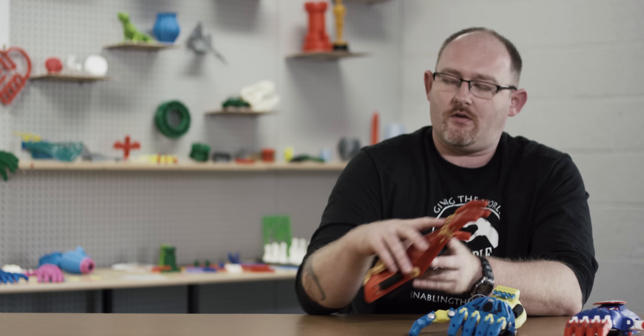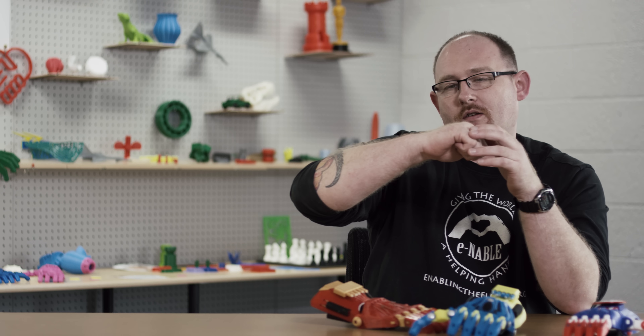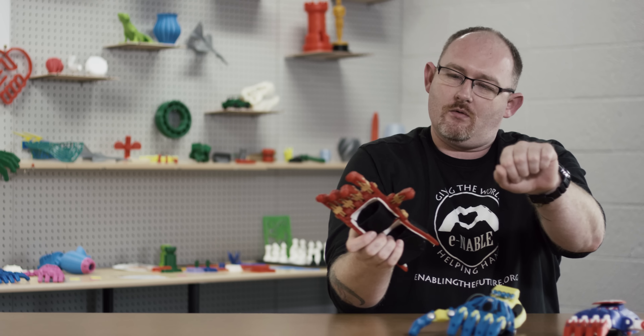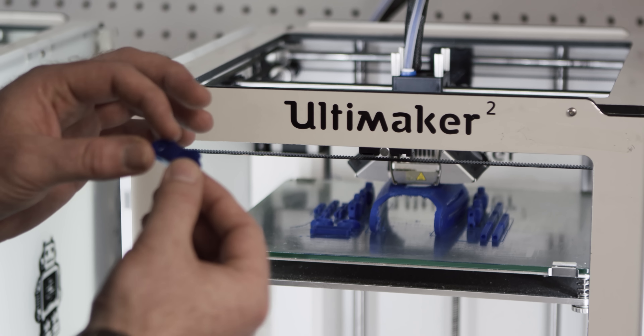Simplicity is key when we're working on these. They're for children and adults that have a partial wrist but are missing most of their hands and fingers, and they're able to still do a wrist-bending motion. When they bend the wrist, it makes the fist. And if something breaks, you can just print out a new part right on the spot.